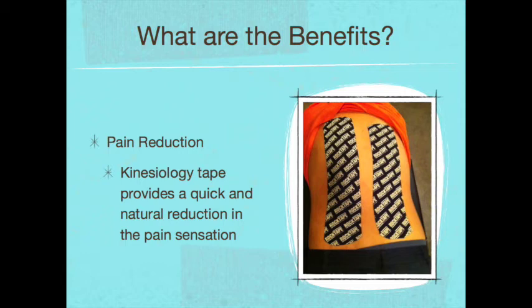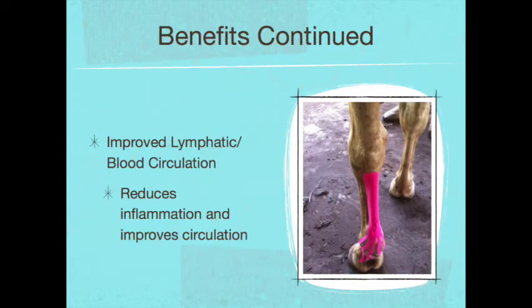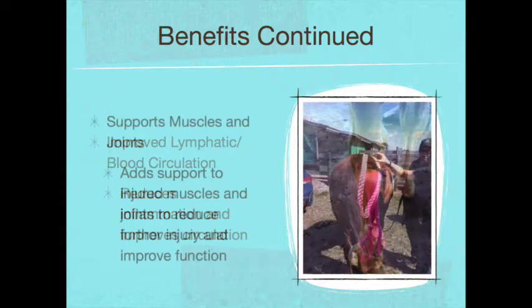Okay, so what are the benefits? One of the main benefits of wearing kinesiology tape is pain reduction. It provides a quick and natural reduction in the pain sensation. We're going to explain why that is shortly. The tape is also going to help improve lymphatic and blood circulation. It can help reduce inflammation and improve the circulation. And again, we're going to explain how that works as well.